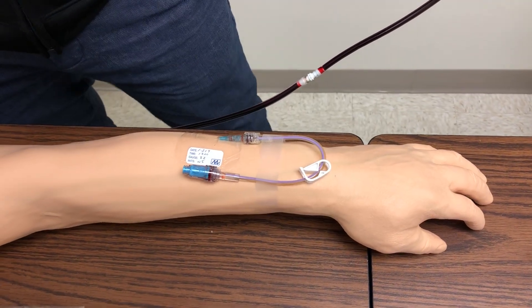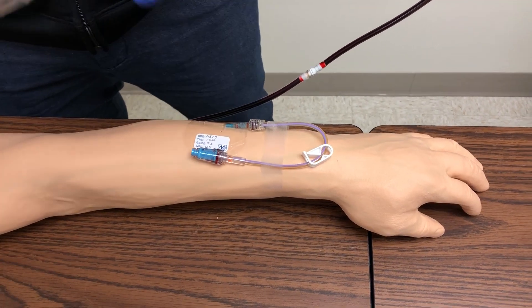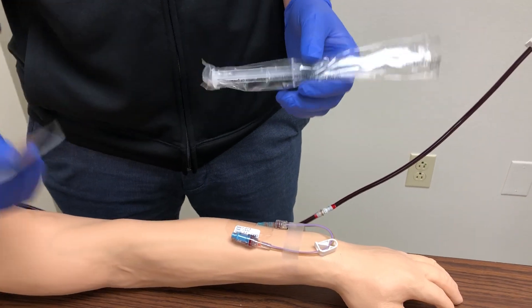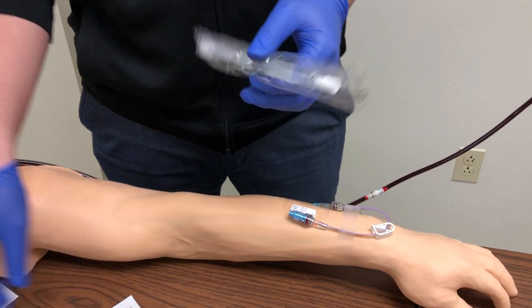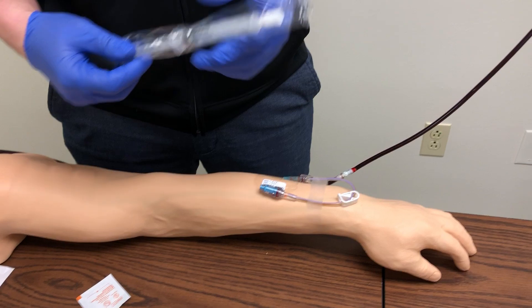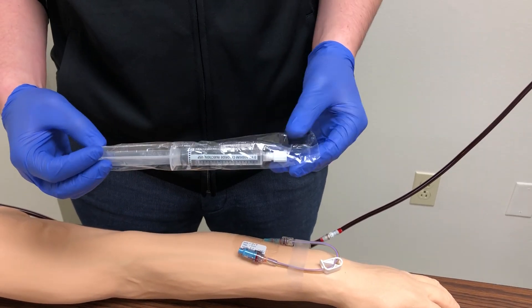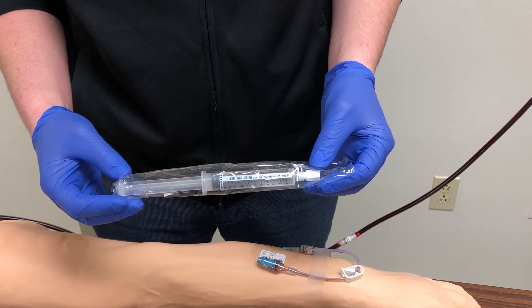To perform a saline flush the supplies you're going to need are a prepackaged 10 ml saline syringe and some alcohol swabs. The first thing you want to remember is that a saline flush is considered a medication, so you want to complete your three checks and your six medication rights before injecting this into an IV.